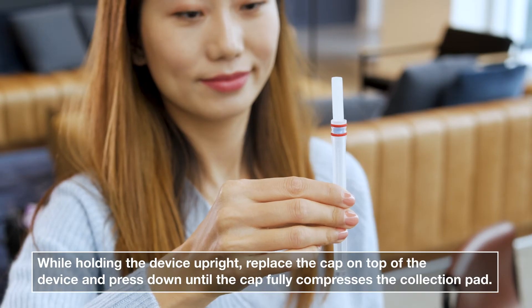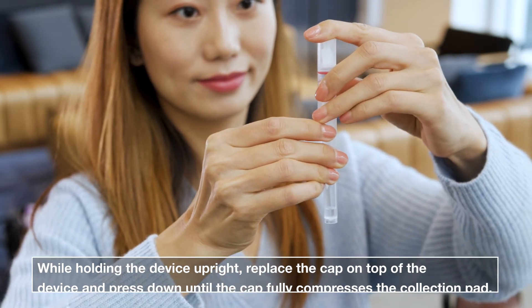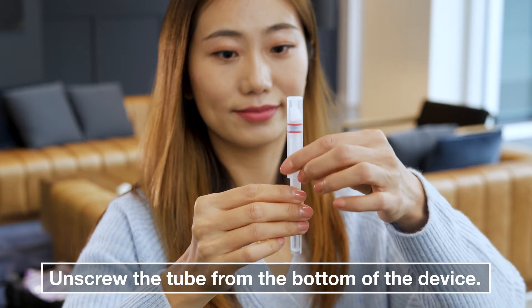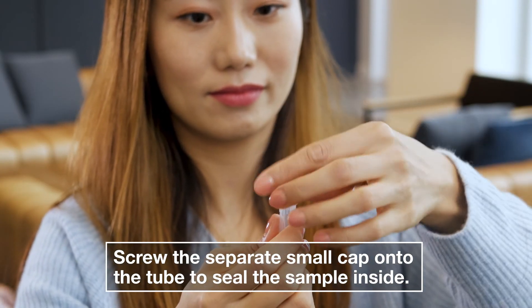While holding the device upright, replace the cap on top of the device and press down until the cap fully compresses the collection pad and forces the saliva into the collection tube at the bottom. Unscrew the tube from the bottom of the device. Screw the separate small cap onto the tube to safely seal the sample inside.